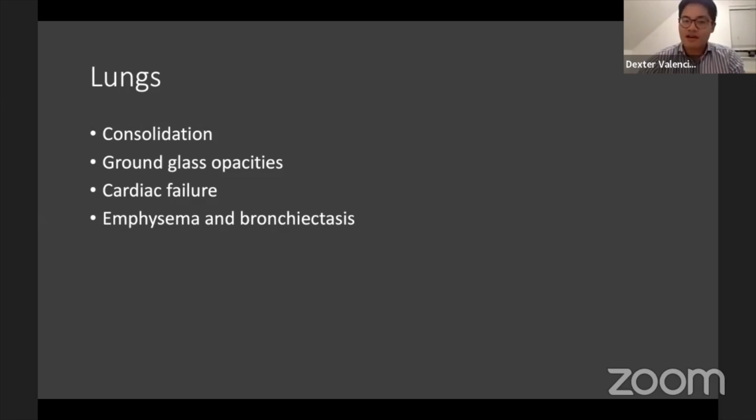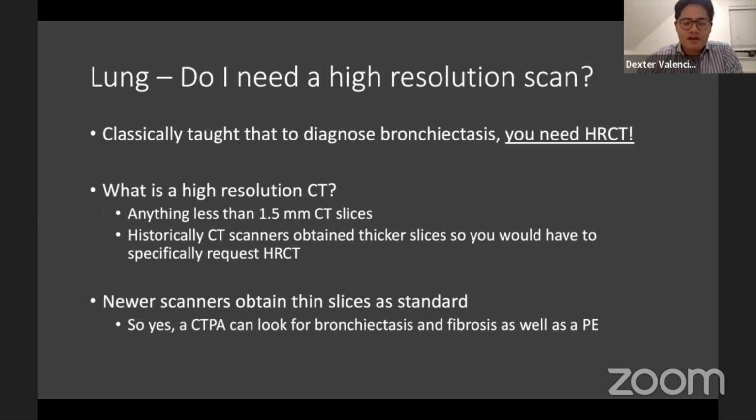It's hard to cover everything else, things like fibrosis and interstitial lung disease, because those are talks by themselves and they're very complex. So I want to get you the most out of the acute things that you'd see which are common. So let's talk about different lung abnormalities.